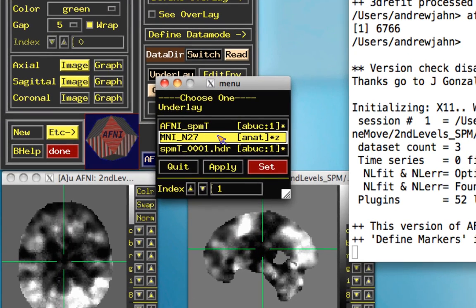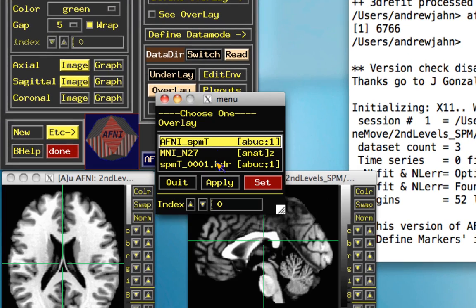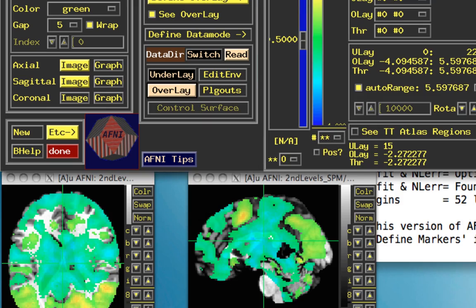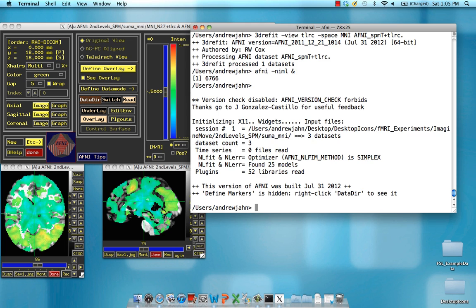For the underlay, I'm going to use the MNI template, and I'm going to overlay these converted SPM results. With SUMA, I need both a spec file and a surface volume. The spec file contains information about the nodes and edges and how they're going to map onto the mesh we're projecting onto. So for the SUMA spec, we're going to use the N27 left hemisphere .spec file. The surface volume is also going to be the MNI_N27+TLRC volume.